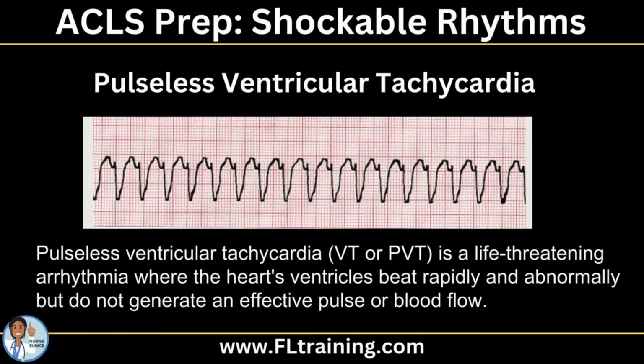So you're always thinking again of your BLS assessment. Anytime there's a change in a rhythm, we don't treat monitors, we treat humans. So if there's a rhythm change, you go and you tap and you shout if that person's not talking to you, and you start feeling for that carotid pulse.